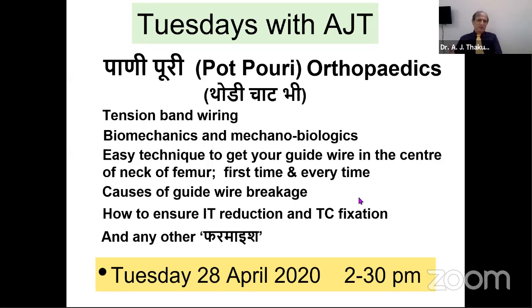When in the emergency room, if you put it in different directions, you will be doing a better service to the patient rather than just blindly putting it on the anterior medial side, which is the easiest way of doing it. And surely most of us would remember that beam getting compressed from top and creating a wedge onto the top layer and bending in a distraction onto the other side. That would be well remembered for a long, long time. That was really very efficiently explained, and that picture would remain in our eyes.